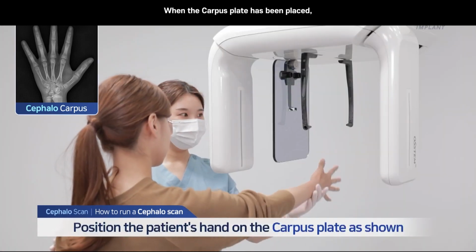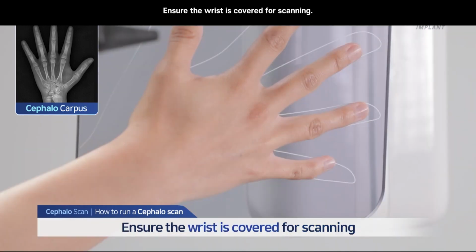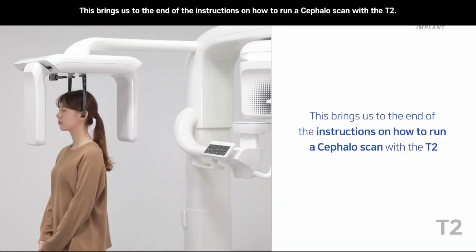When the carpus plate has been placed, put the patient's hand in the position shown on the plate. Ensure the wrist is covered for scanning. This brings us to the end of the instructions on how to run a cephalo scan with the T2.